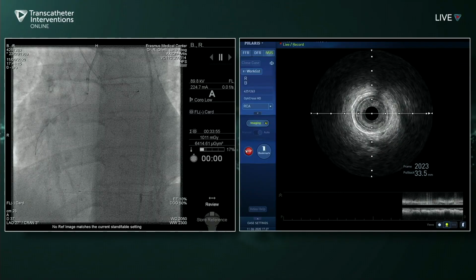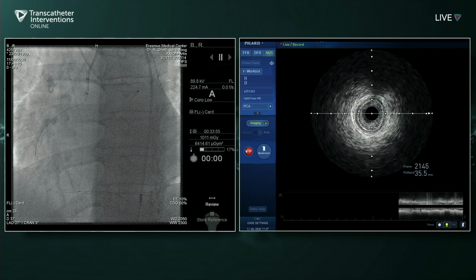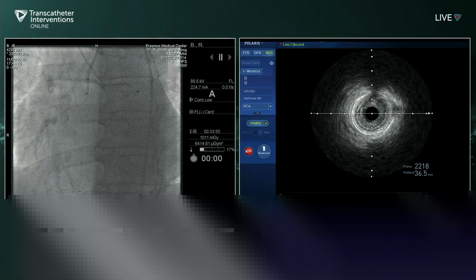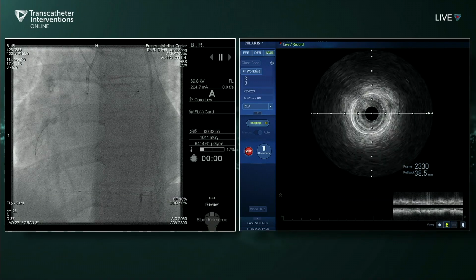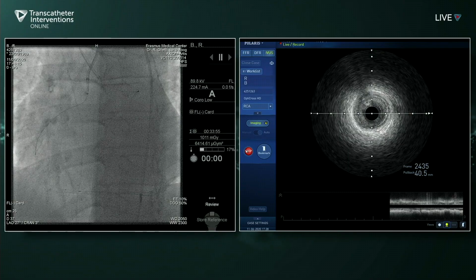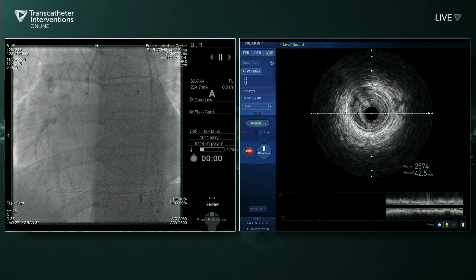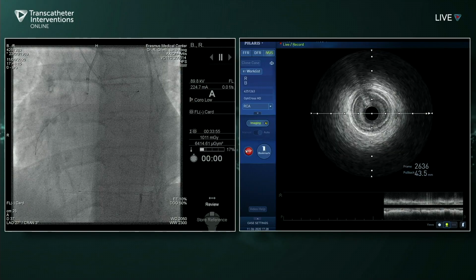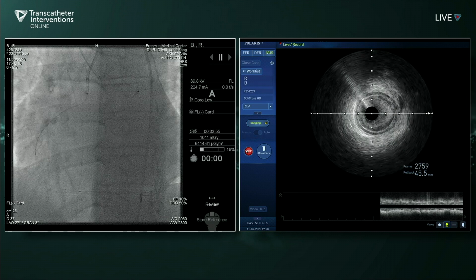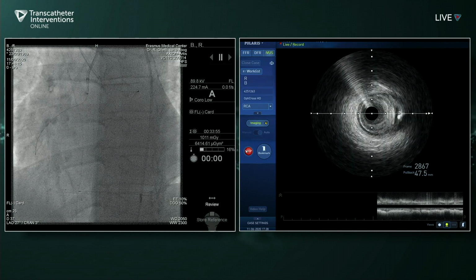Okay. Oh, so you wanted to, Bert, was that the high definition IVUS? Yeah, it's the high definition IVUS. I like it a lot for this kind of procedure. It's amazing because you can really see also the flaps, and in this case, it's really nice. It's a good compromise between IVUS and OCT. Yeah. Just have to flush the catheter pretty well to start.